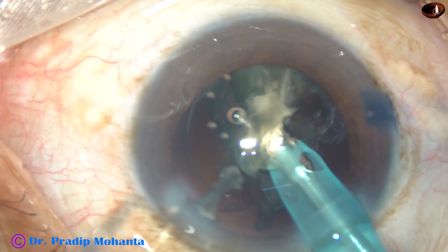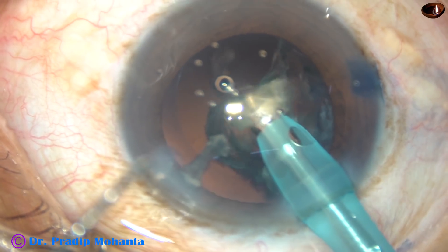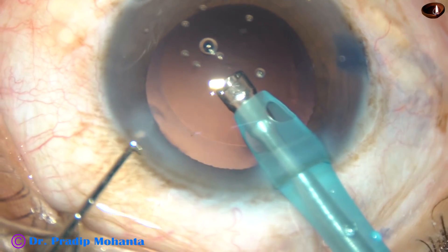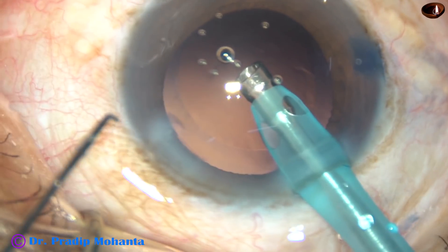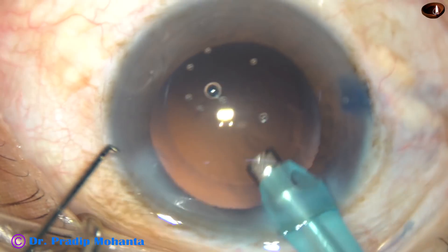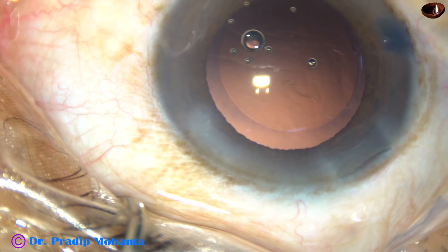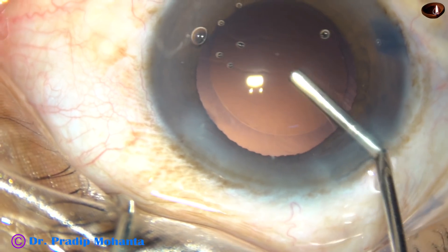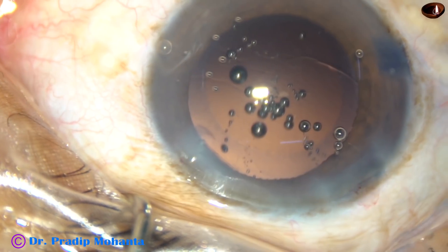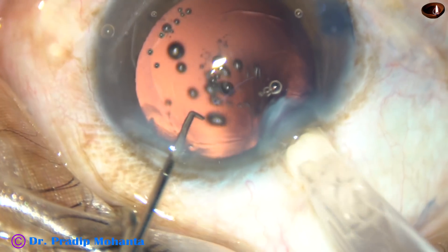This is the last portion of the nucleus. I have removed the chopper for better stability of the anterior chamber. There was no surge. We see that there is no cortex in this case. The posterior capsule is clean. So inject viscoelastic substance and implant the lens.